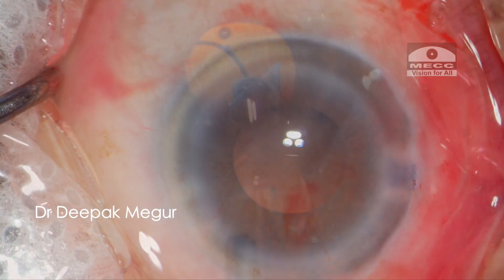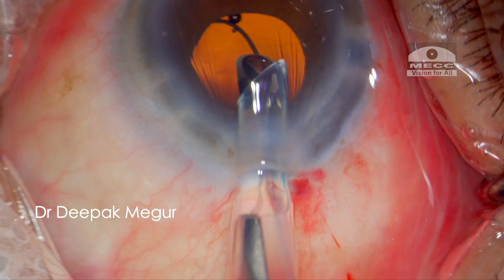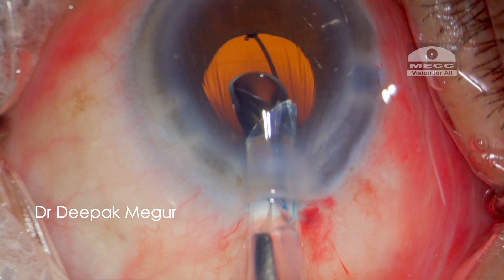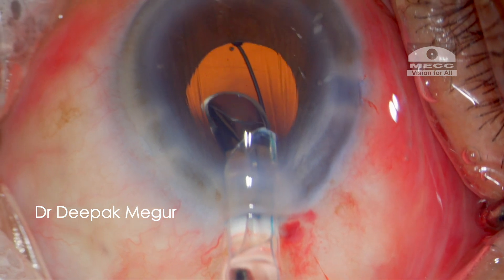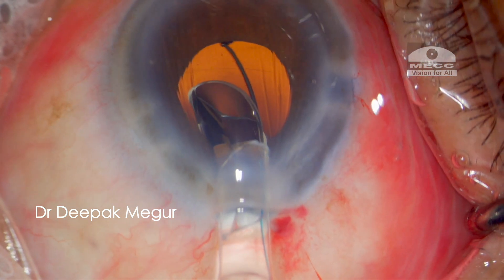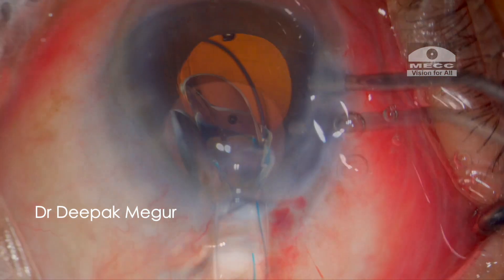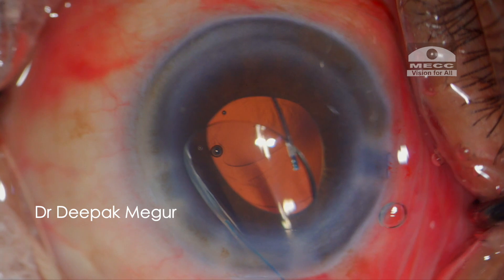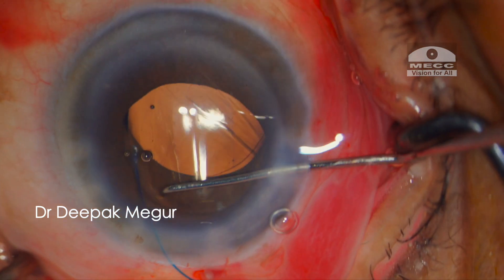During the IOL implantation, the anterior chamber was shallower and I could see the wrinkling of the posterior capsule because of the enhanced red glow, prompting me to use OVD to deepen the bag for an uneventful implantation of the intraocular lens. So the red glow did come in handy in enhancing the safety during surgery.